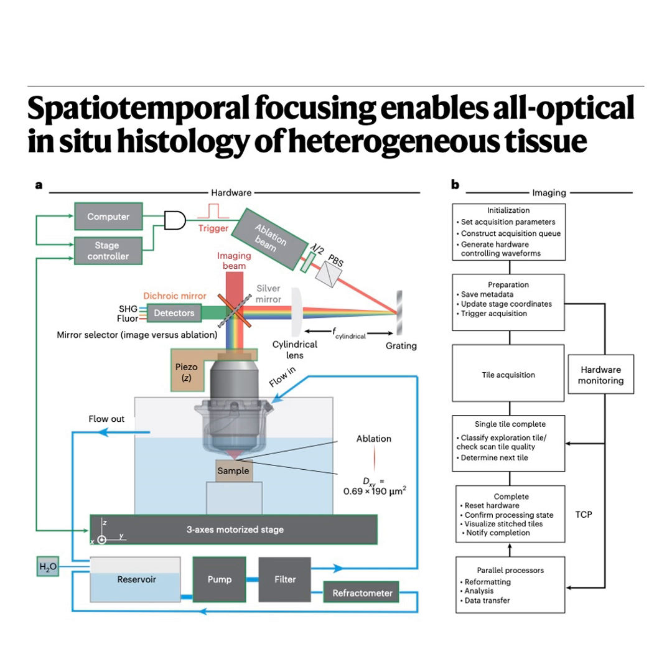Very localized removal, minimal damage to the underlying layer you want to image next. So that's the goal. And the final reconstructed volume, how big was it? It was massive for this level of resolution. They successfully imaged and computationally stitched together a volume of 5.4 × 4.2 × 1.8 mm³. That's a huge chunk of the mouse head, rendered as a single coherent 3D dataset.